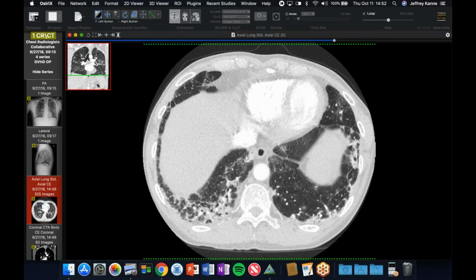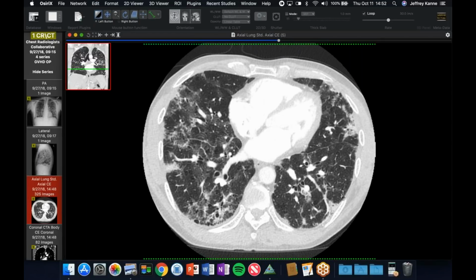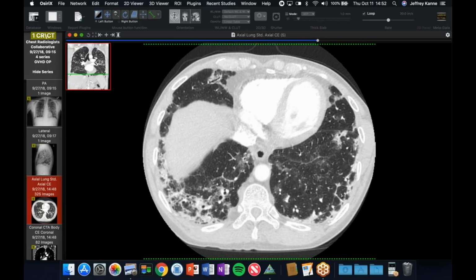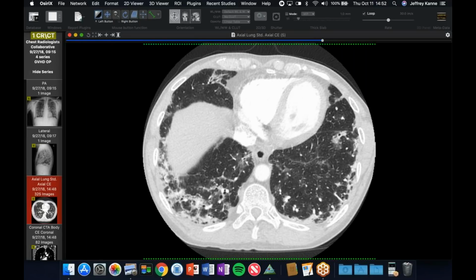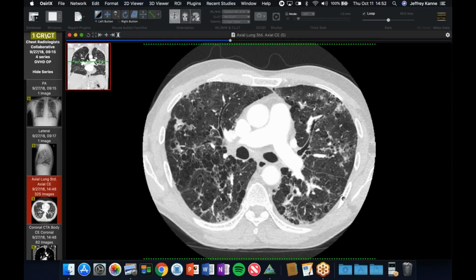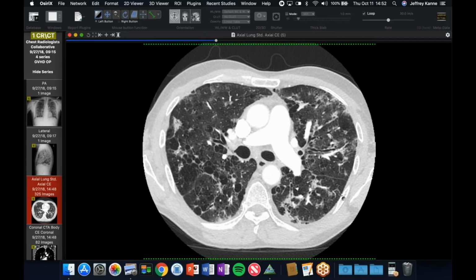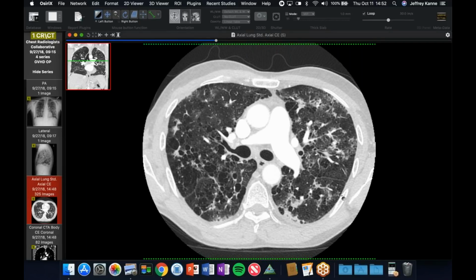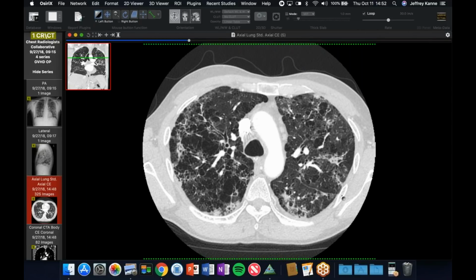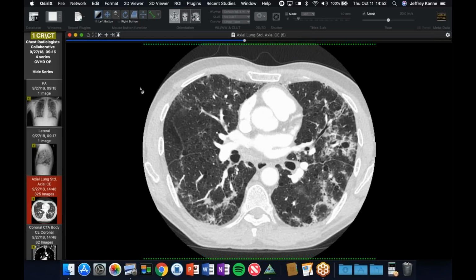And of course, this could be infection, but it's pretty symmetric and quite extensive. And so the other thing to always think about is that this is an excellent look for a drug reaction, but also an excellent look for acute graft versus host disease. And this is what this was. He had a bronch and it ruled out infection. And he had some other signs of acute GVHD in his skin and whatnot. We see a lot of chronic graft versus host disease manifesting as air trapping as the most common finding, but acute is less common. I always tell my residents it pretty much looks like infection and drug toxicity, so you have to include that if appropriate. So, nice example.